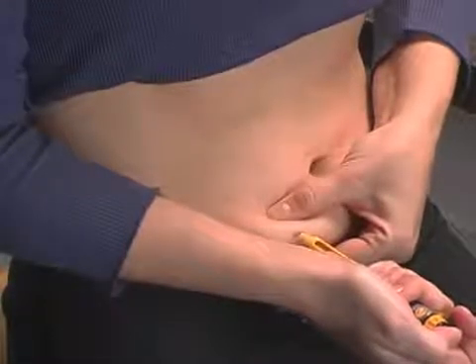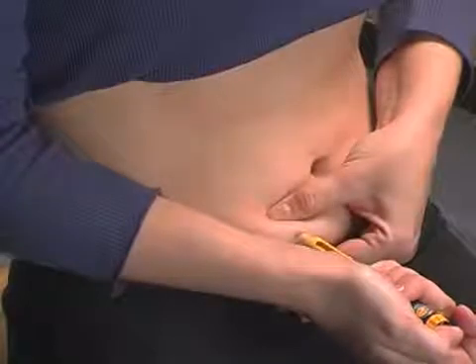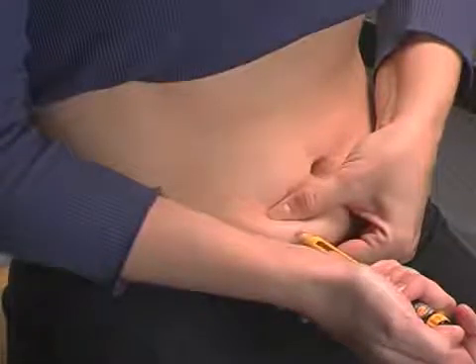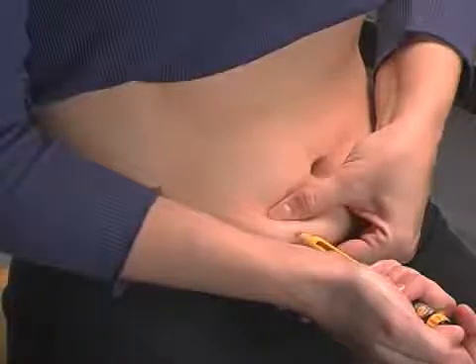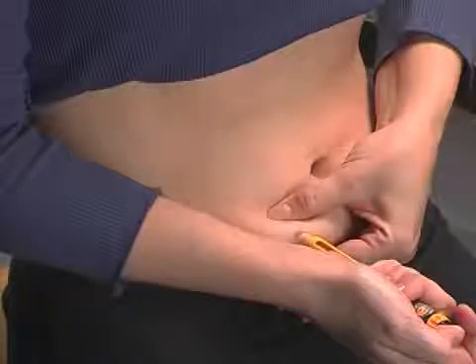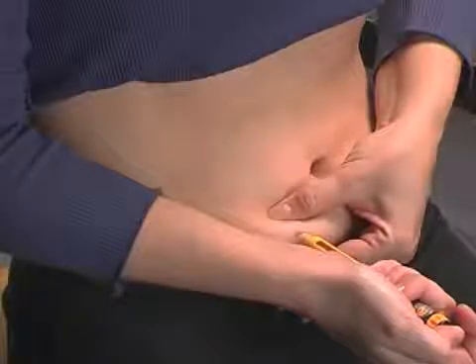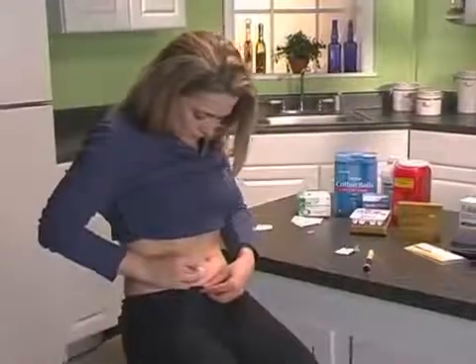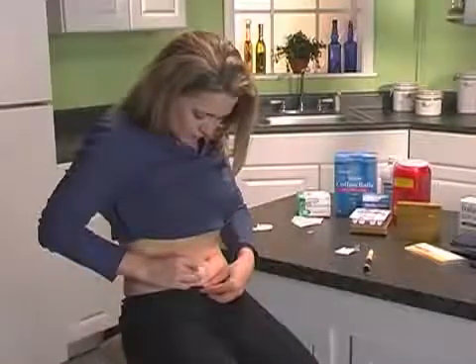Fully press the end of the injection button to make sure you give yourself a full injection. Wait 5 seconds before removing the needle from the skin. The middle of the dosage window should display a dot next to the 0. Pull out the needle. Firmly press an alcohol pad over the injection site for 5 seconds.